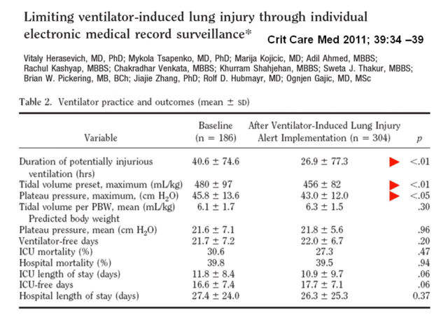Look at the results. This is baseline, and this is after ventilator lung injury alert implementation through this sniffer algorithm. They found that the duration of potentially injurious ventilation was markedly decreased by applying that system. The tidal volume was significantly decreased, and the plateau pressure was also decreased.